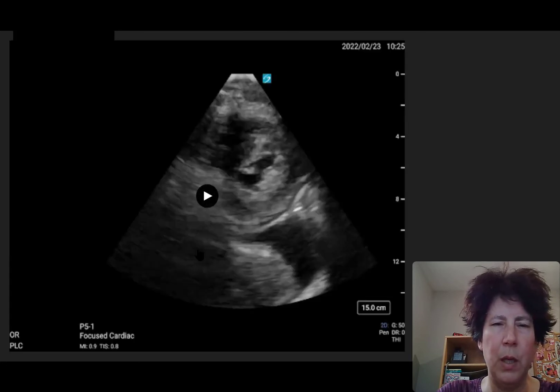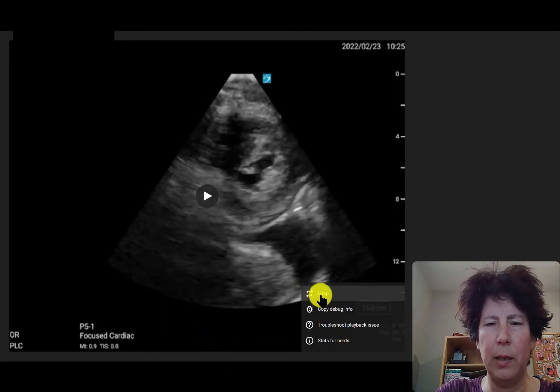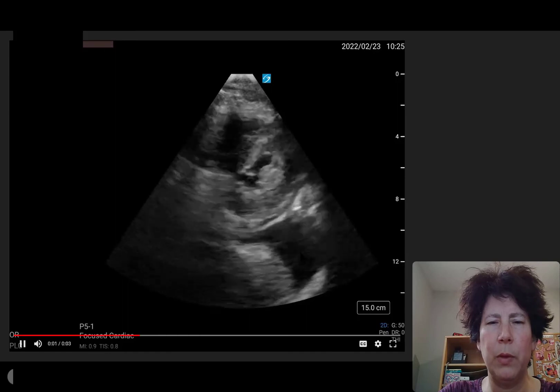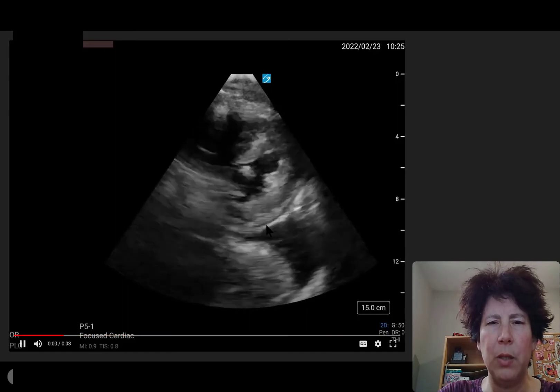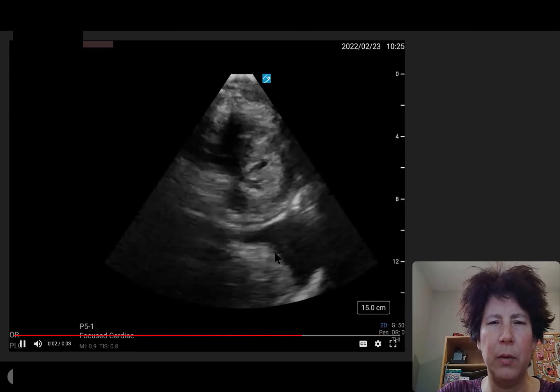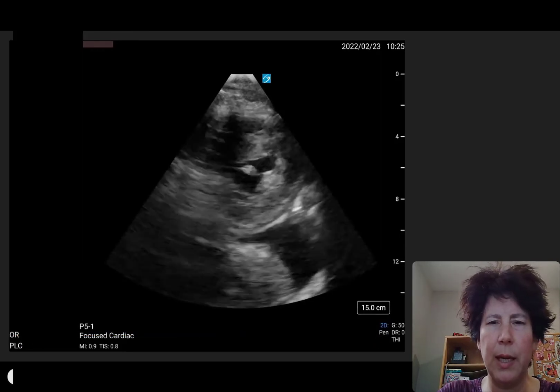This is what we saw on the cardiac echo — a very hyperdynamic heart with fluid behind it. We were a little challenged to determine where exactly this fluid was, but I think in terms of how the image is shot, this is likely ascites versus pleural effusion. Interested in other people's opinions on this too — just a very interesting case with lots of good information: the B-lines, pleural effusion, tissue-like lung, and the hyperdynamic heart.